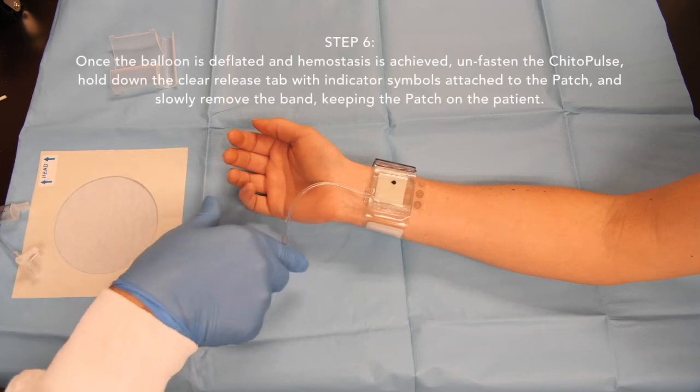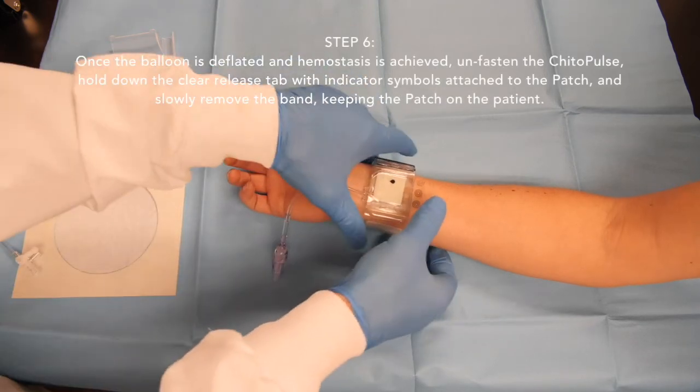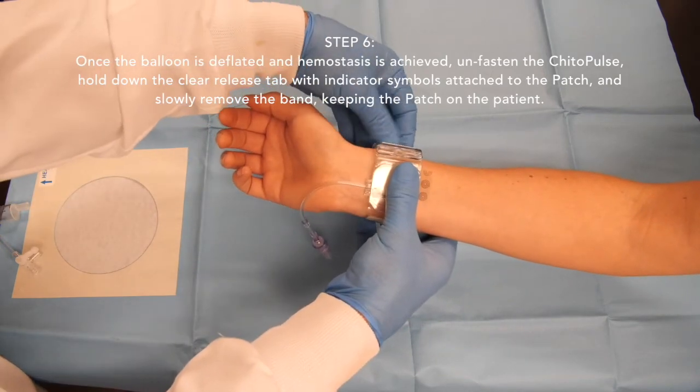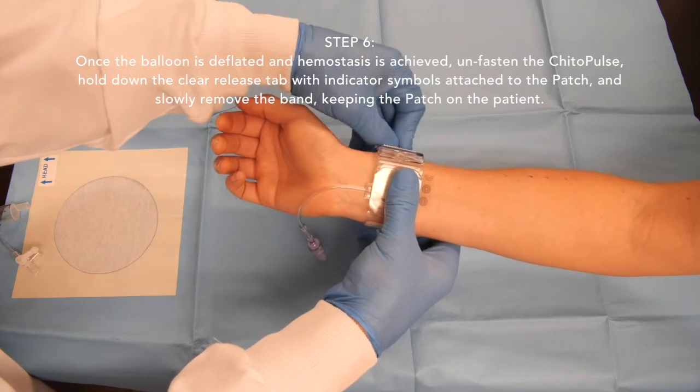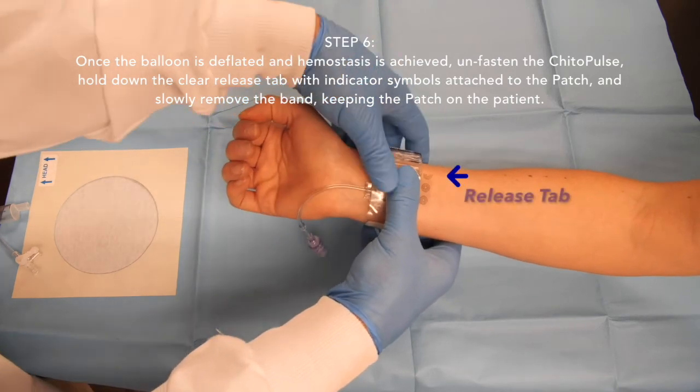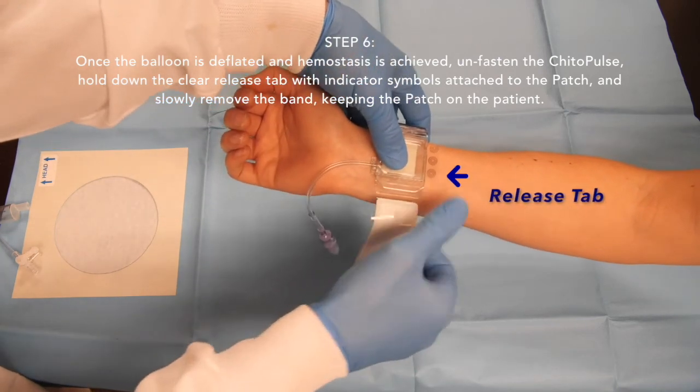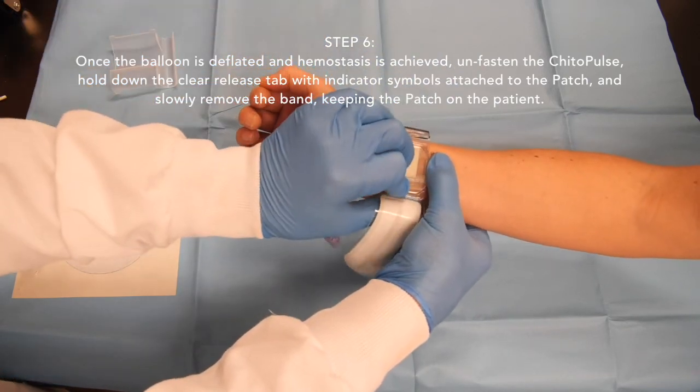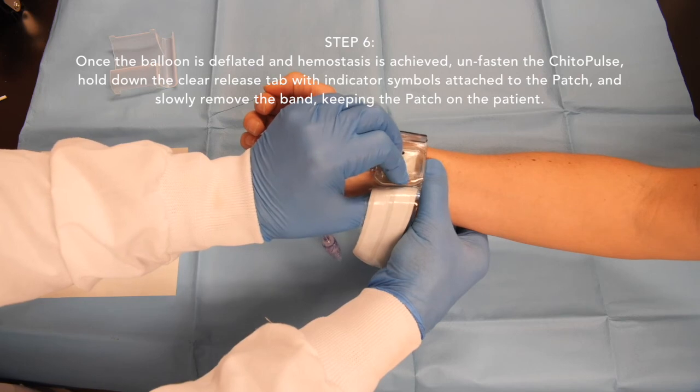Once the balloon is deflated and hemostasis is achieved, unfasten the ChitoPulse. Hold down the clear release tab with indicator symbols attached to the patch and slowly remove the band, keeping the patch on the patient.